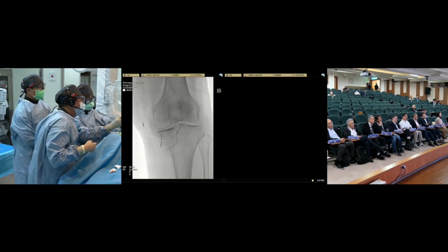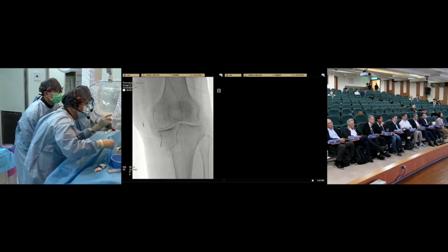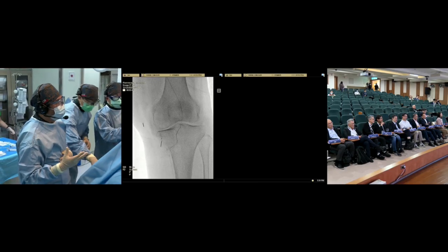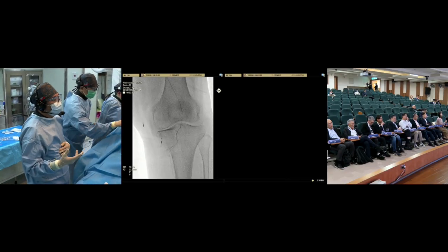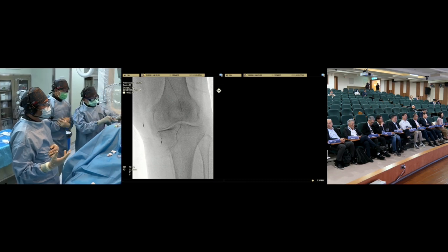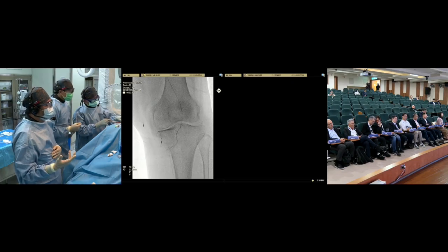Do you feel painful now? Yes. Is this one of the places that usually hurts? Yes. So we do the embolization and ask her whether she feels evoked pain, and she says yes. And I asked her whether she usually feels painful in her usual day, and she says yes. So I know this is the target vessel. So where we treat is good for her.